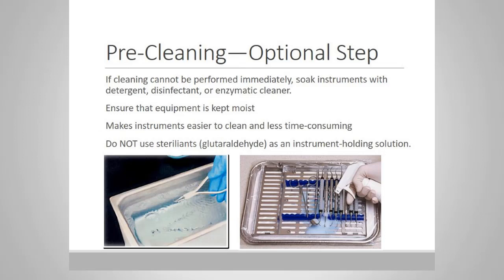There is an optional step called pre-cleaning. Say you work in a high volume practice and you cannot get to your instruments right away, this step might be for you. This step includes immersing instruments in a detergent or an enzymatic cleaner or a disinfectant, or spraying with an enzymatic solution.